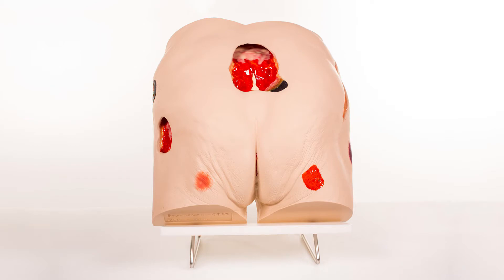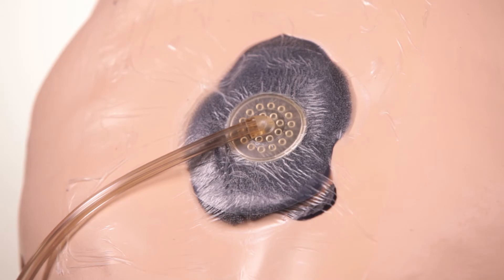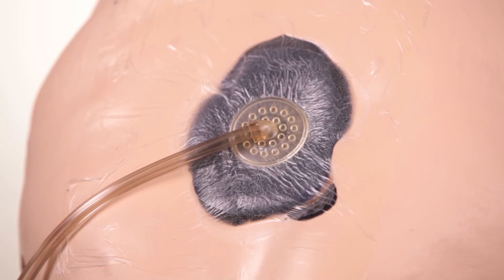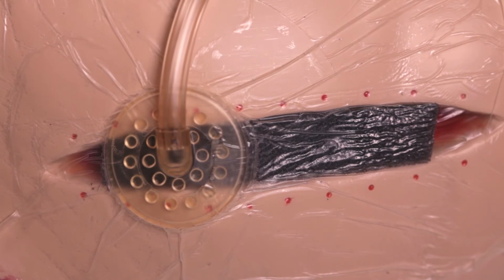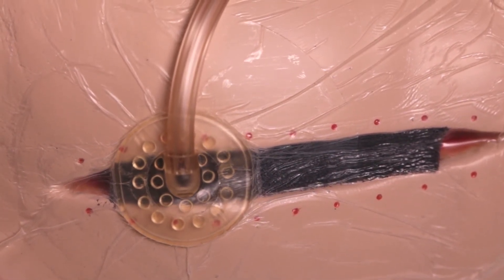In the gluteal cleft is a possible rectal fissure. The Seymour II wound care model is made of a unique material that permits the application of negative pressure wound therapy dressings. This can be done on the stage IV and dehiscent wounds. The edges of the dehiscent wound will actually start to close when the negative pressure pump is activated.